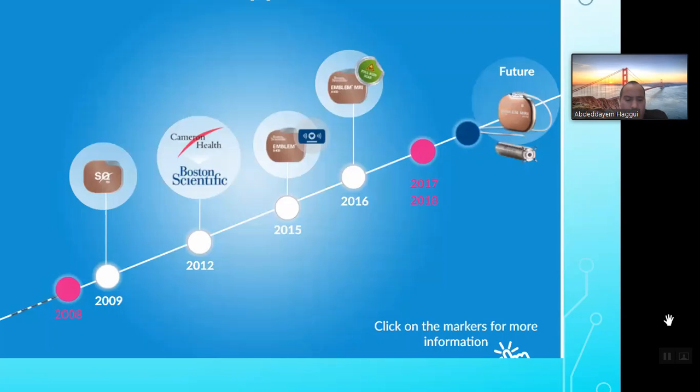Now I want to talk about the history of the SICD. In 2002, the proof of concept study began and the first generation SICD system was born. The SICD system gained market approval in Europe in 2009 and in the United States of America in 2012.